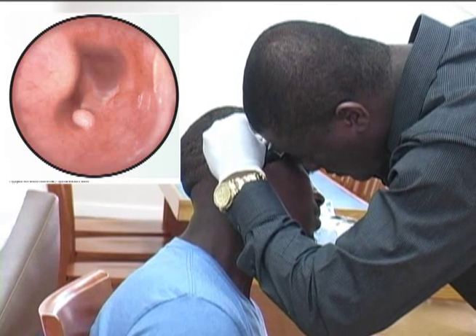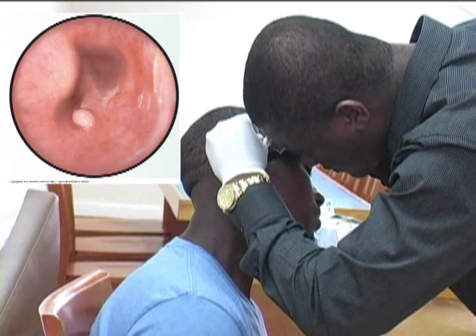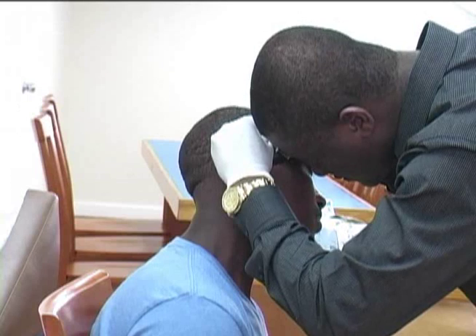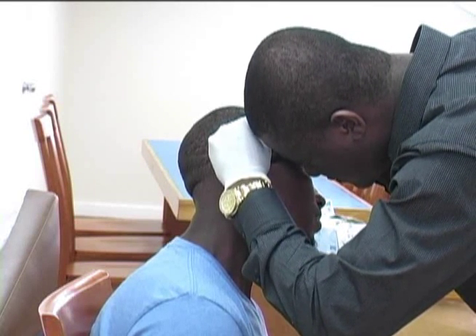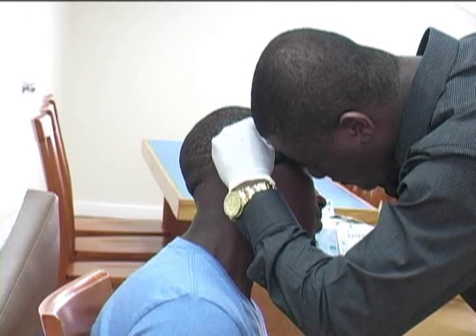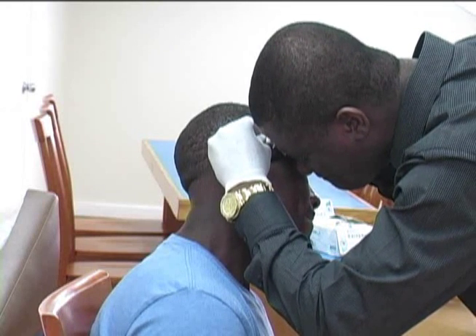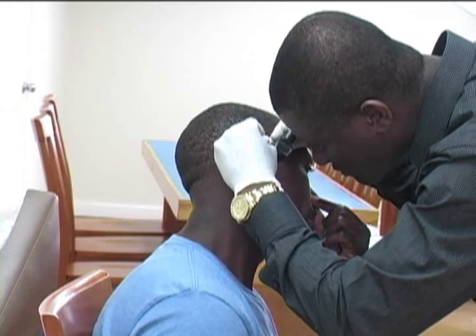Visualize the tympanic membrane. The tympanic membrane is ovoid, semi-transparent, and pearly gray in color. There is some mobility of the membrane on carrying out the Valsalva maneuver. Take a deep breath in, then with the lips together and the nares closed by pinching with the thumb and index finger, attempt to breathe out forcefully.